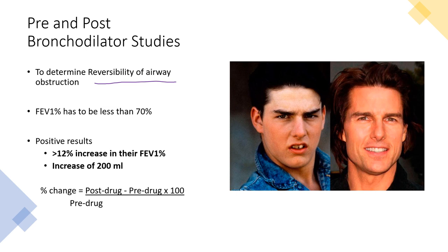So you're going to do a PFT. You're going to have them do a forced vital capacity, and you're going to get a baseline value. And then you're going to wait usually 10 to 15 minutes for the medication to kick in, and then you're going to do a post. And you're going to have them do a forced vital capacity again.